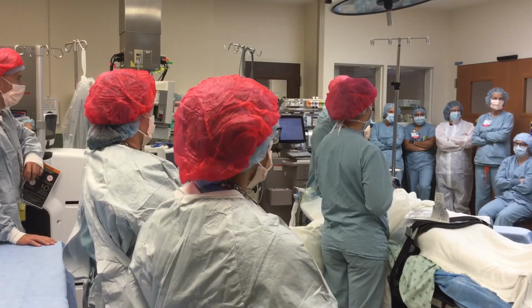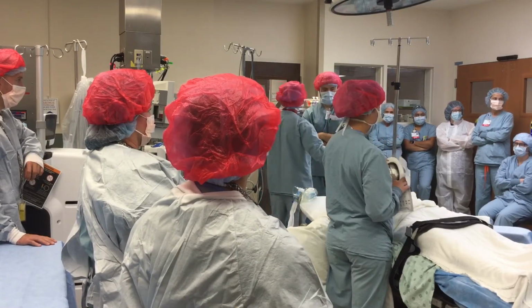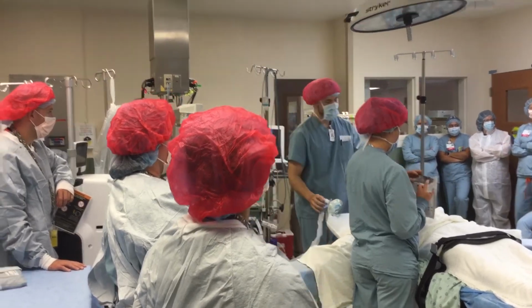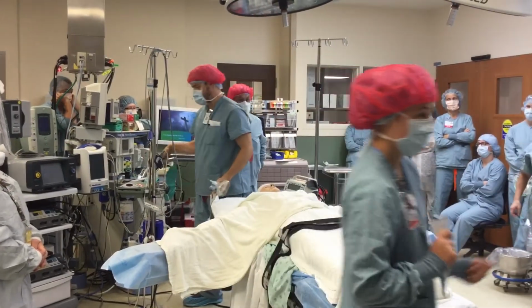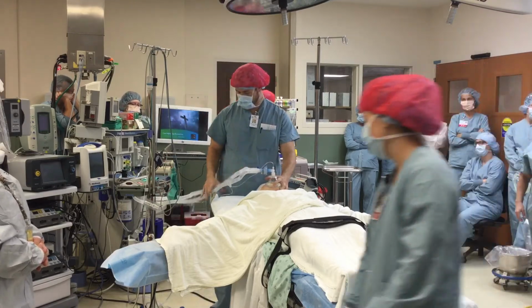Nothing's happening yet. We're going to say start, and then we're going to recognize the rhythm, and then we're going to go from there. Okay. Are you ready? We are.